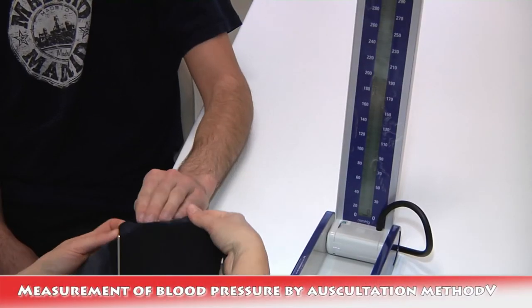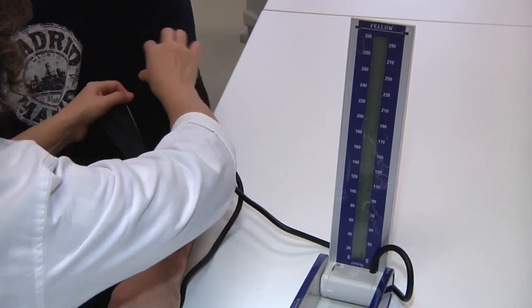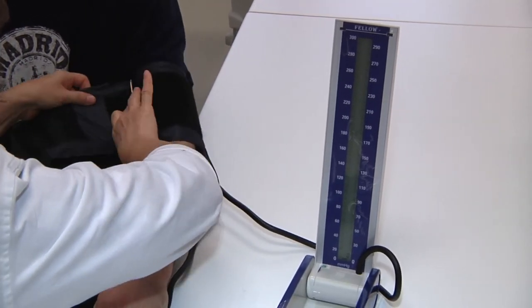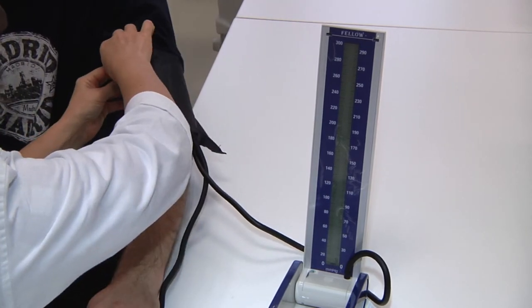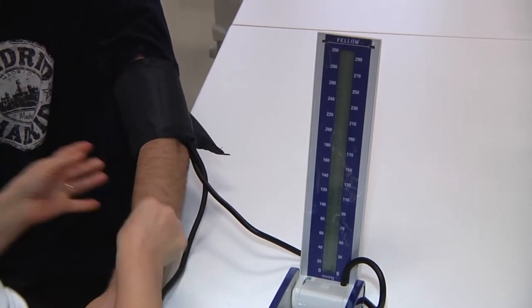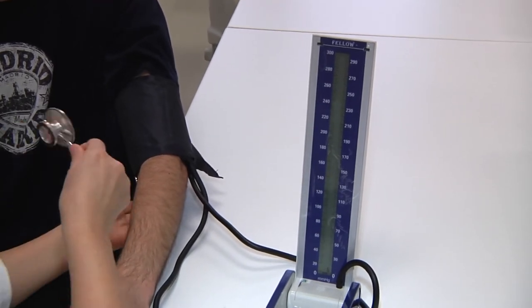This practical task will demonstrate the auscultation method of blood pressure measurement. After proper application of the cuff on the arm, it should not be too loose or too tight. We will put the stethoscope into the cubital fossa to listen to sound phenomena occurring here later.